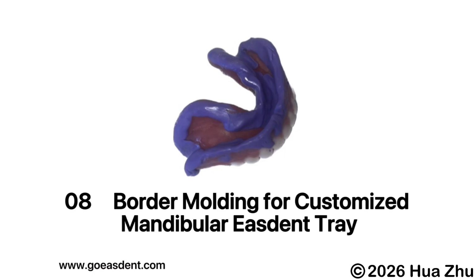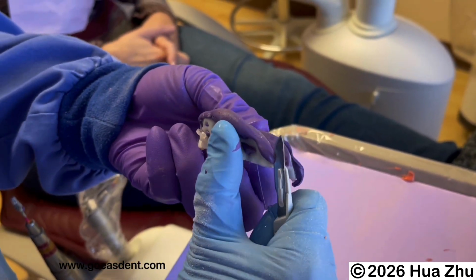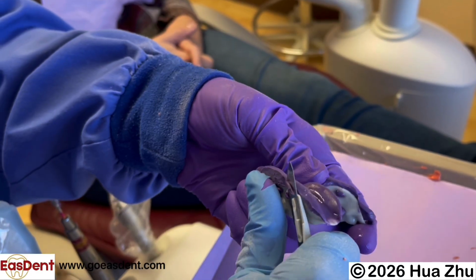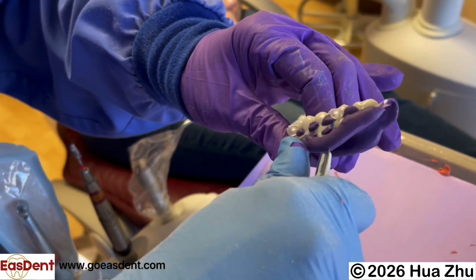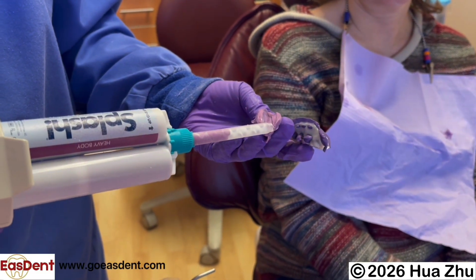Border molding for customized mandibular Easdent tray. Check the borders to see if the border is too thick, which means you have overextension, just like the maxillary Easdent tray. Trim away the extra material before you start border molding. Short areas can be filled by border molding. Use heavy body PVS material to do the border molding.